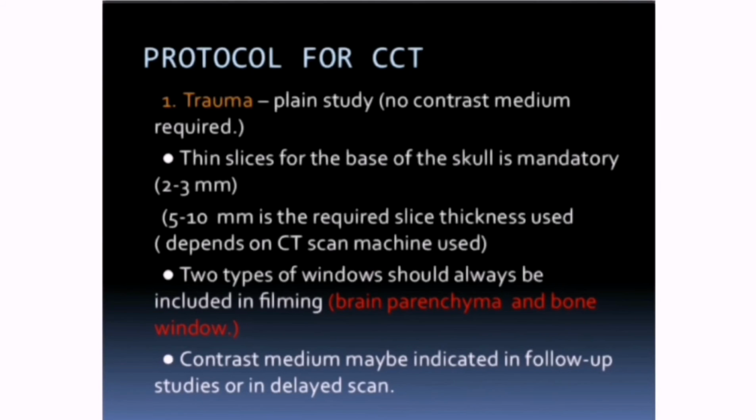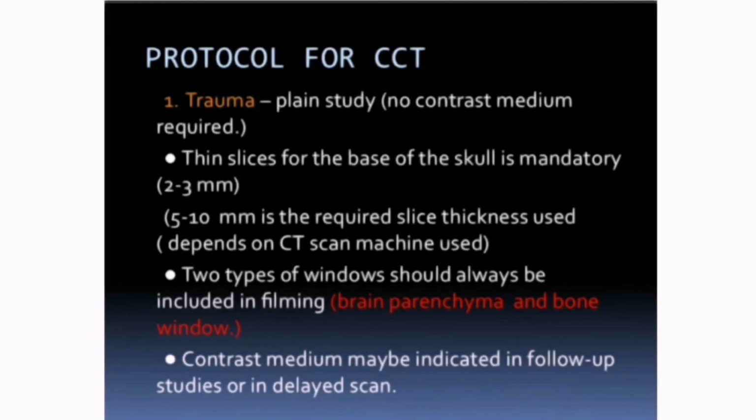For trauma, plain study or no contrast medium required. Thin slices for the base of the skull is mandatory. Two types of windows should always be included in filming. And contrast medium may be indicated for follow-up studies or in delayed scan.